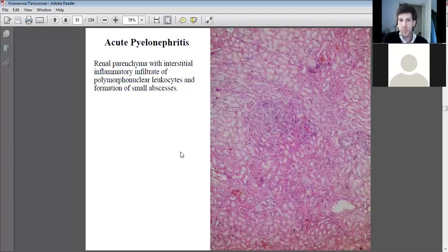Okay, so this whole area here is inflamed. There's lots of cellular debris, and with inflammation you get lots of cellular debris. Here we're having a lot of activity. Lots of white blood cells, I would say leukocytes and macrophages, working together to attack infective agents in this area here. The small abscesses that result are sort of spotted around. So let's see if we can find some.